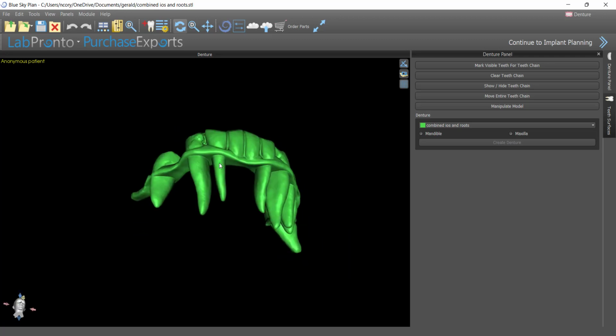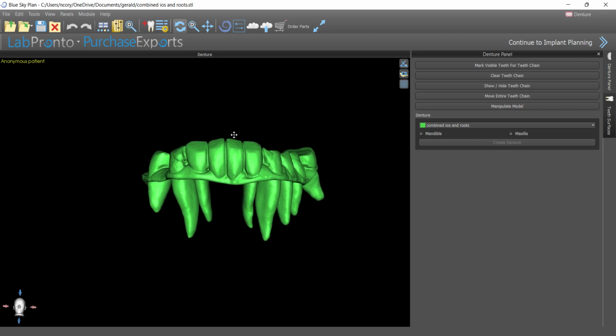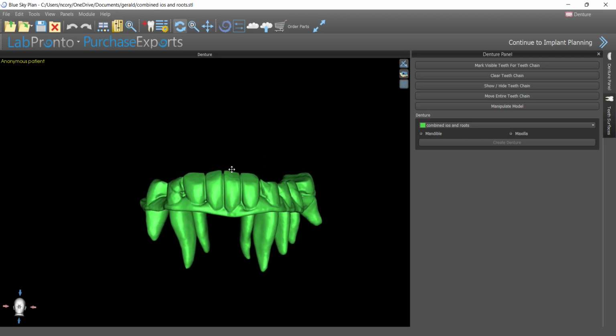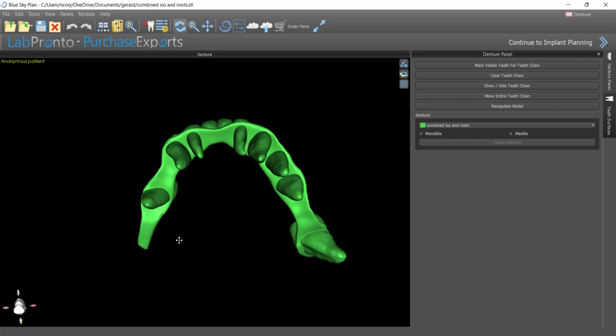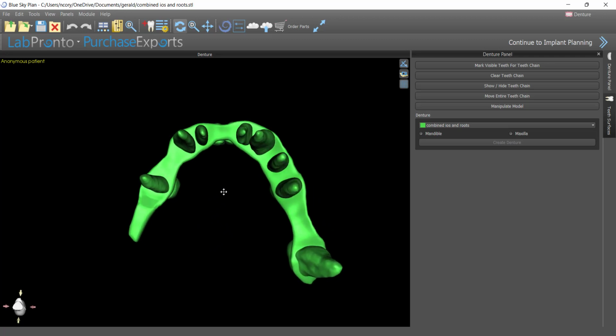So you've got to think a little abstract right now. This has to insert this way into the mandible, okay? So what I really need is a path of draw looking from this direction. I want to indicate a path of draw from this direction and block out any undercuts that may be present. All right, hopefully you're following that.